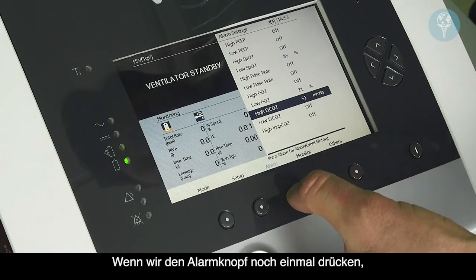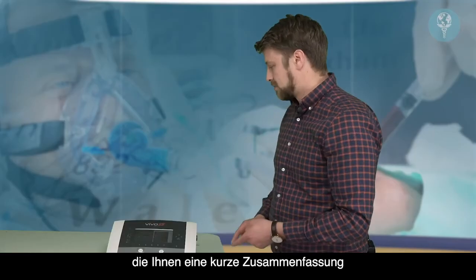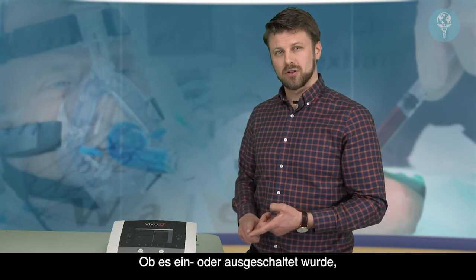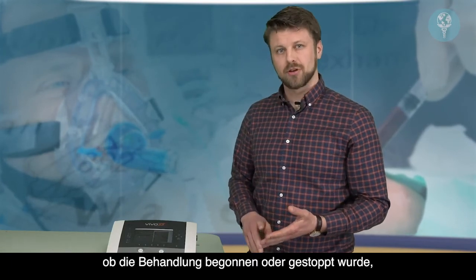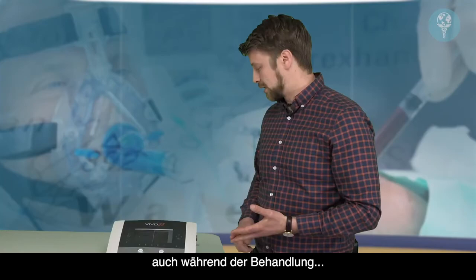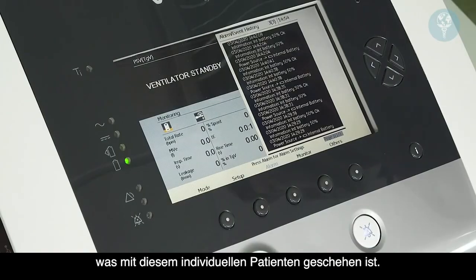If we press the alarm button once more, we come into the alarm event history, which will give you a brief summary of everything that's happened with the device. That includes whether it's been switched on or off, treatment has been started or stopped, and all alarms that have been triggered during treatment as well. So you can go back and review what has been happening with that individual patient.